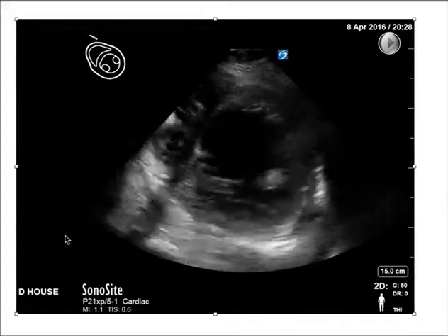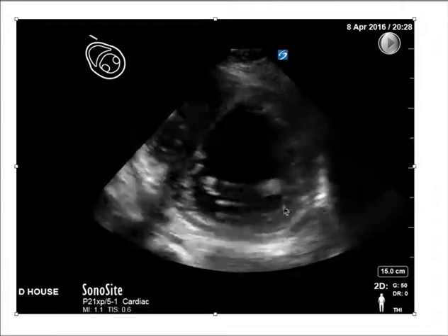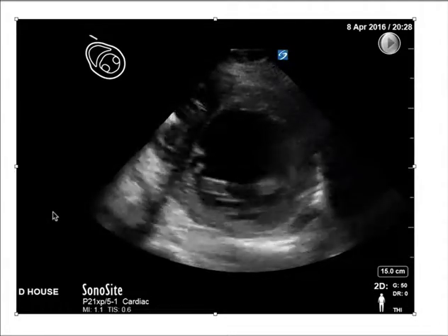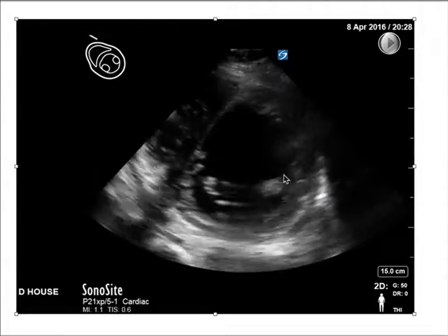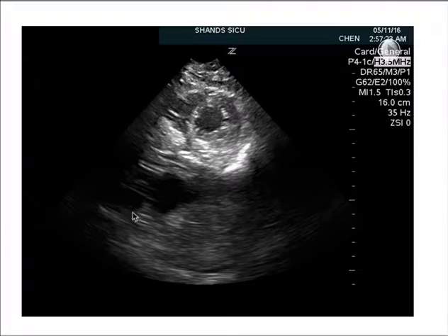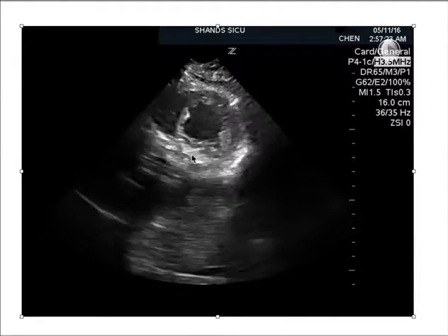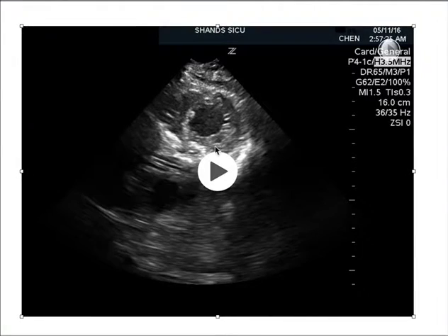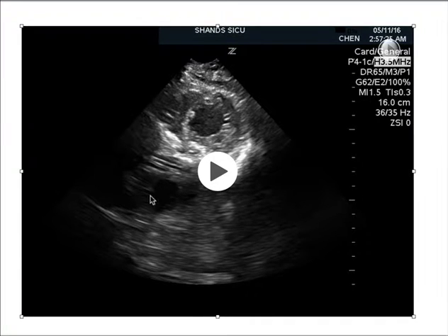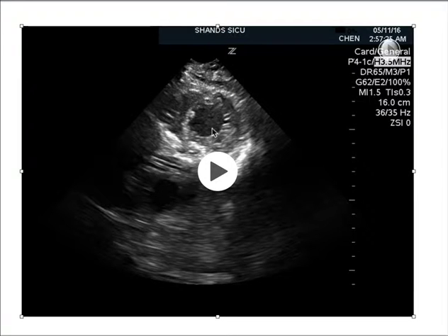Here's a short axis view of poor function — you see the papillary muscles and the LV is definitely not fully collapsing. Here's a patient probably imaged at the apex without clear papillary muscles — don't be tricked into thinking this is good function just because it appears to collapse; you're only looking at the apex. Always identify the papillary muscles.